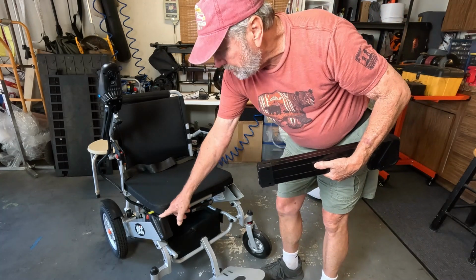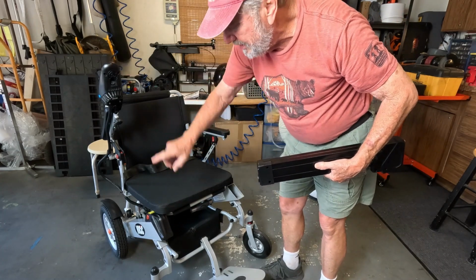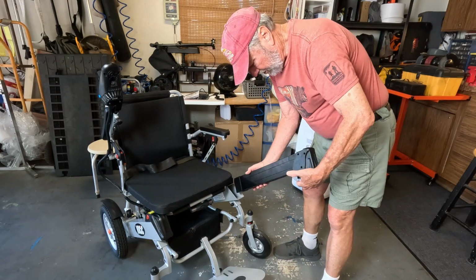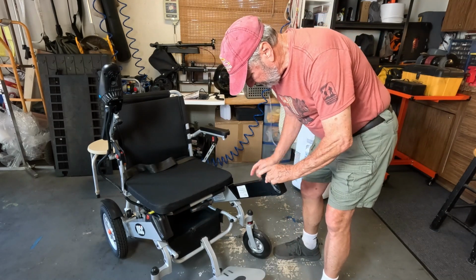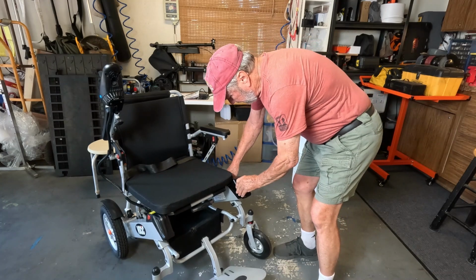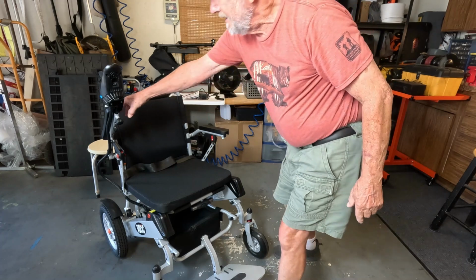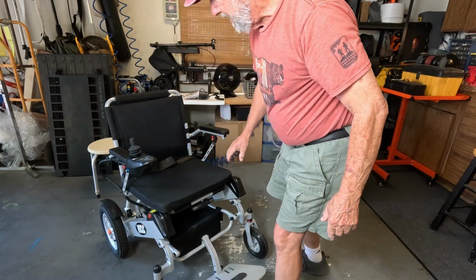But this is the only place that's going to charge this and this side only. This is just a storage location. Always goes up here, and you have to line it up. Okay, and that will snap down.